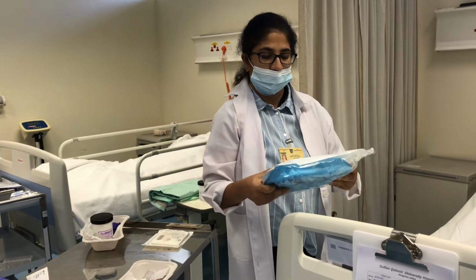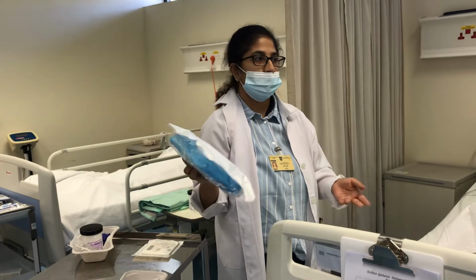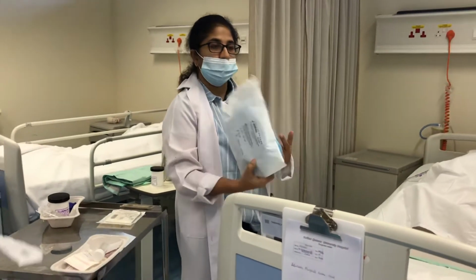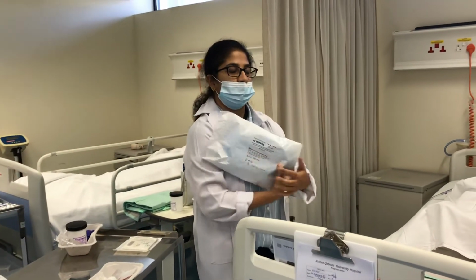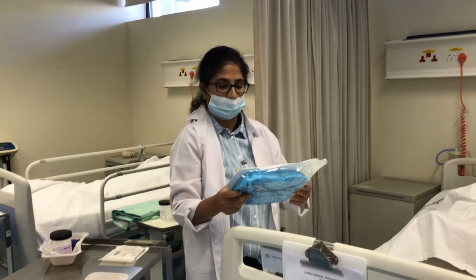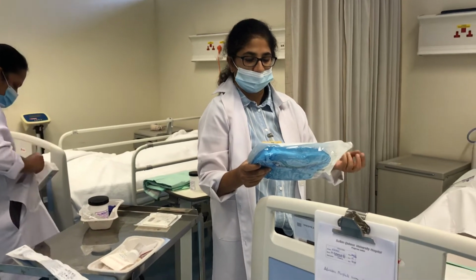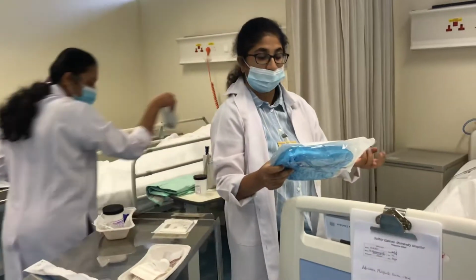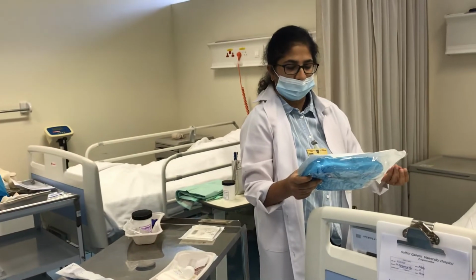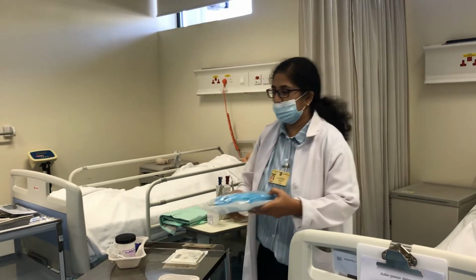So here the catheterization pack is a sterile one, just like the dressing set. The contents are written here, which include the swabs, then the yellow waste pack, then balls, that is the cotton balls, then a kidney basin, then some forceps and some tissues. So these are the contents.